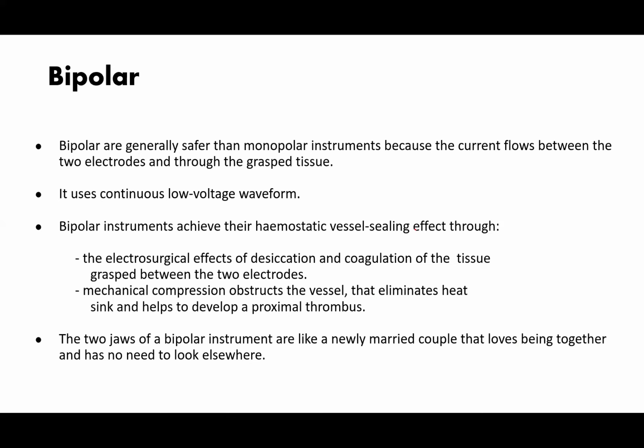Now the bipolar. Bipolar instruments are generally safer than monopolar instruments because the current flows between the two electrodes and through the grasped tissue. It uses continuous low voltage waveforms. Bipolar instruments achieve their hemostatic vessel sealing effect through, one, the electrosurgical effect of desiccation and coagulation of tissue grasped between the electrodes. So when it grasps the tissue, it causes desiccation and coagulation.